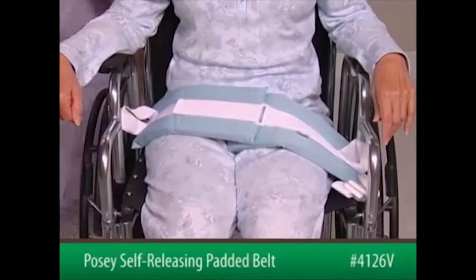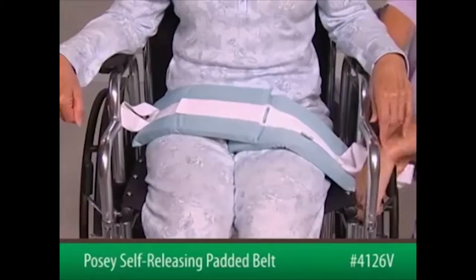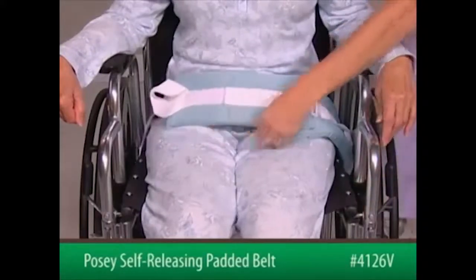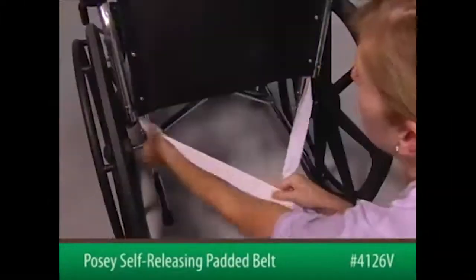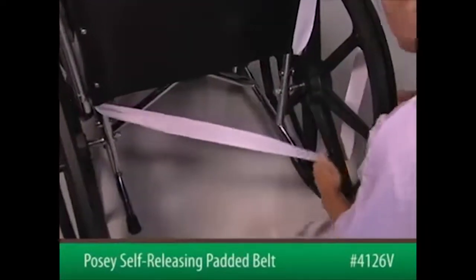Bring the ends of the connecting straps down between the seat and the wheelchair sides at a 45-degree angle. Gather the straps and take the first strap and wrap it tightly around the opposite sidekick spur.